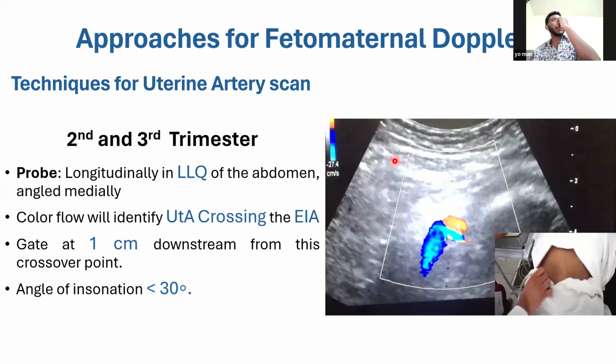In preeclampsia, as time goes, doing a uterine artery Doppler might not be that helpful for the patient. If you identify preeclampsia by screening at 12 or 13 weeks, you can place the patient on low-dose aspirin, which is of great benefit, okay?